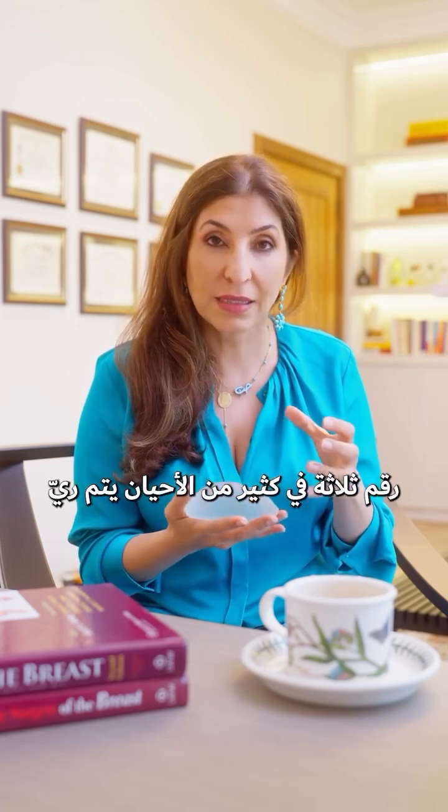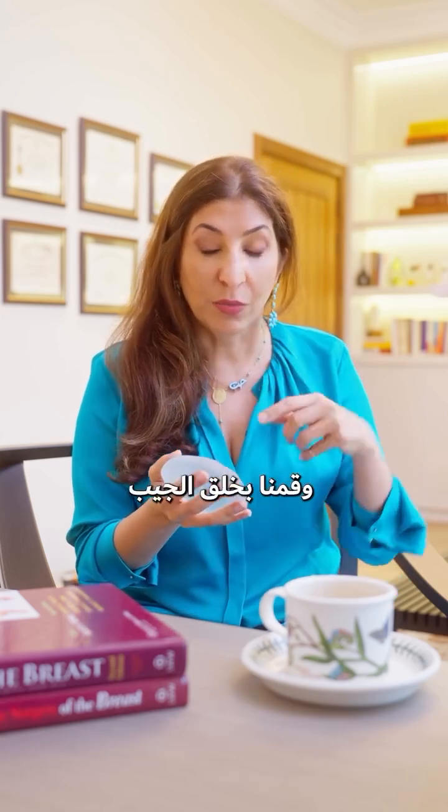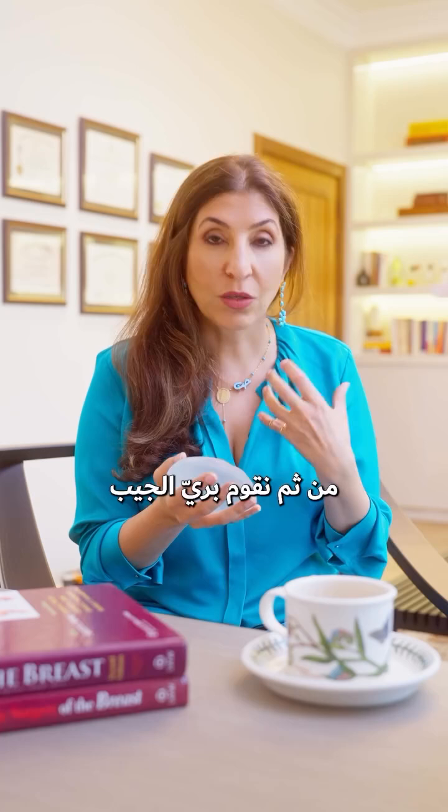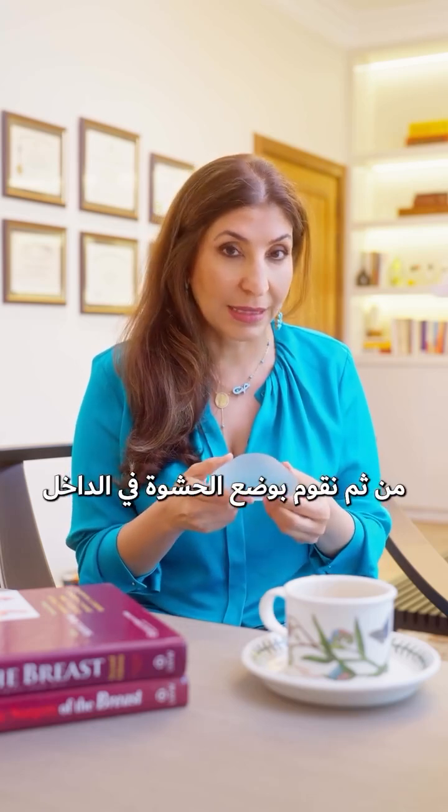Number 3, the pocket is often irrigated with an antibiotic solution. So let's say we've started the procedure, we've made our incision, we've created the pocket. We then go in and irrigate the pocket with antibiotic solution. And once we've irrigated the pocket with antibiotic solution, we then place the implant in.